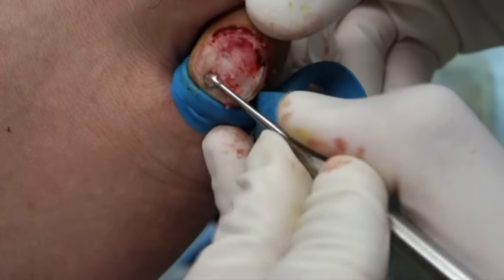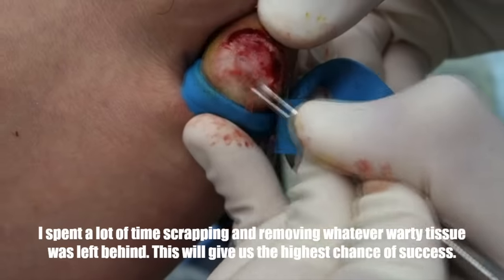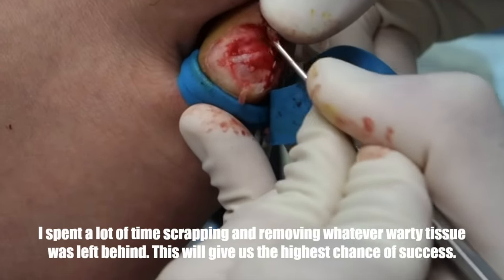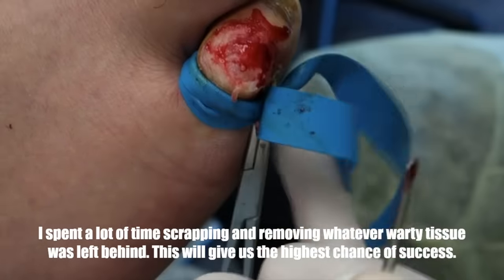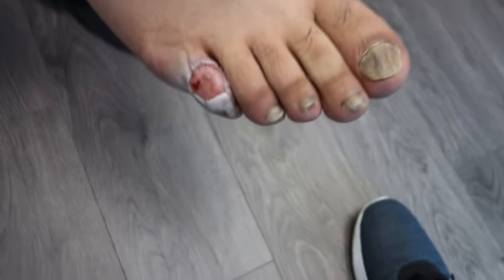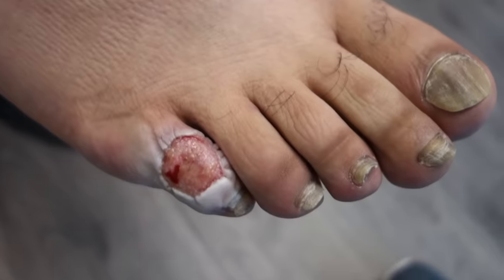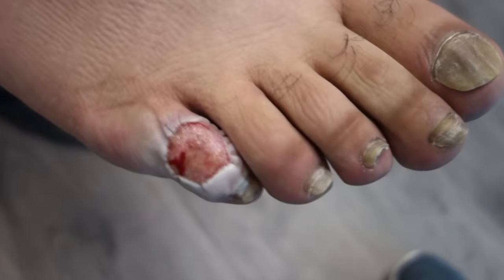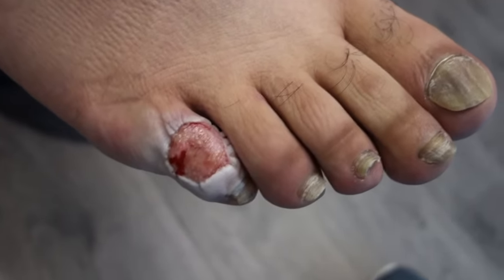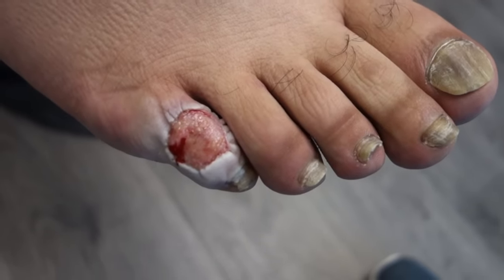I'm gonna scrape down as much as I can, then we apply electricity, then we apply acid — and that's the best we can do. Two times every day. As you can see it's really moist. There's no signs of infection, no redness, no pus, no smell. Pain level is okay? It's like a 2 out of 10.